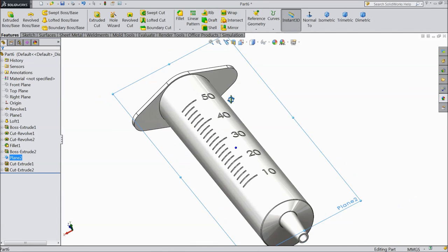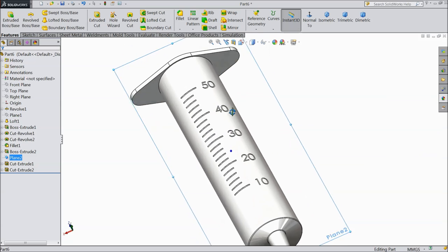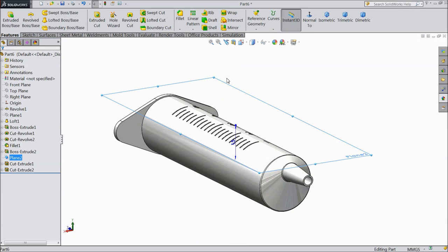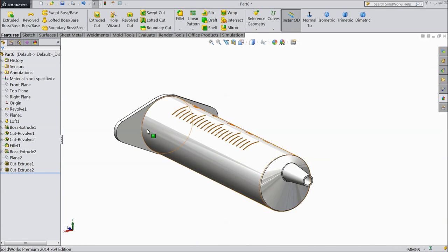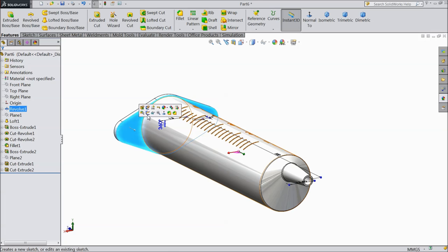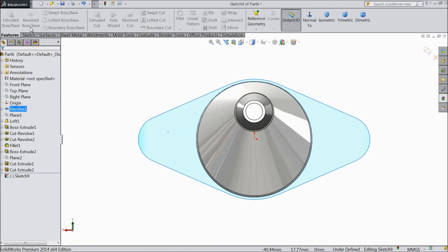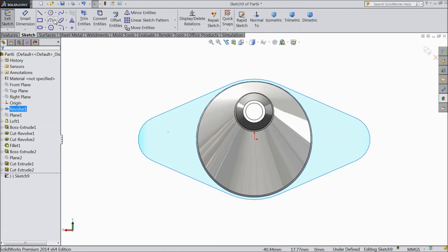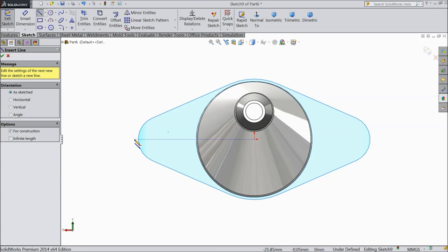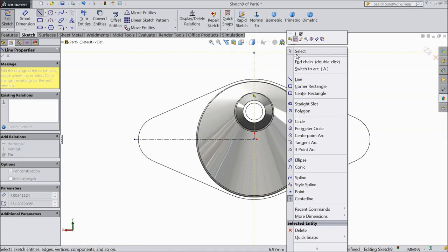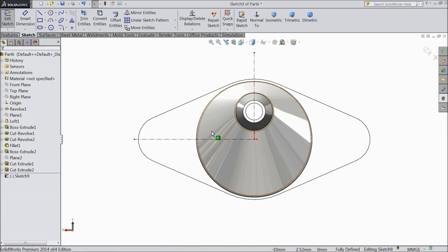Now see — the numbers are projected. Now hide this plane. Select this face, sketch normal.